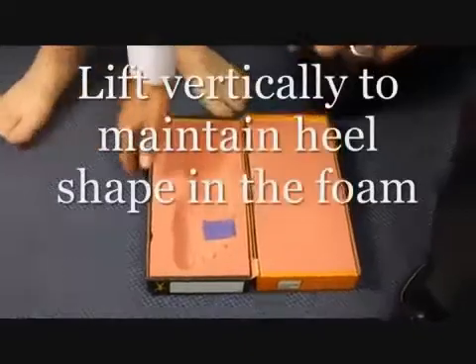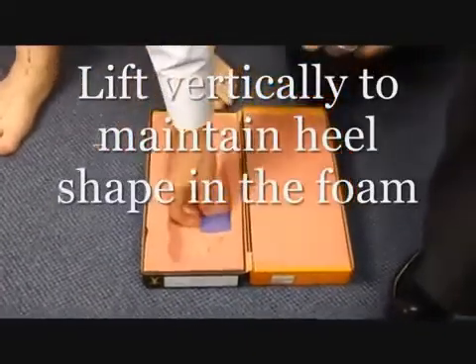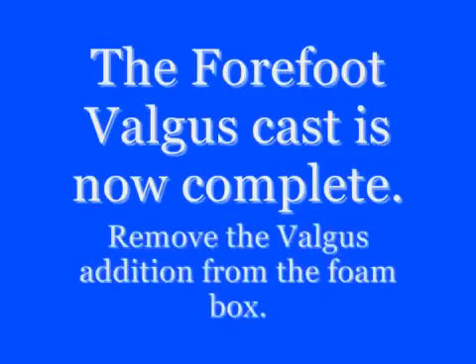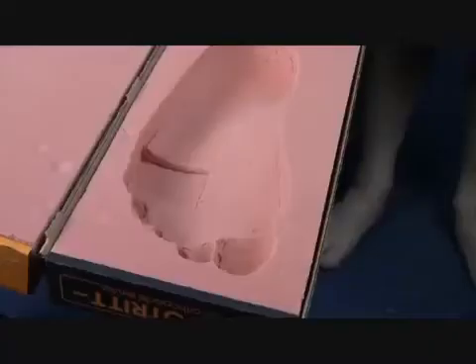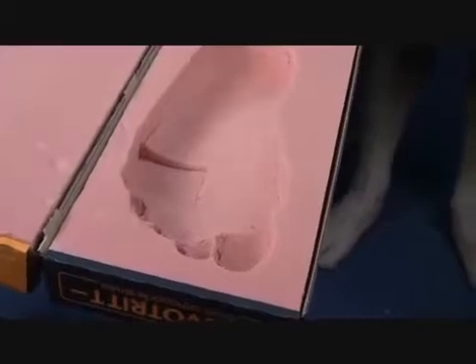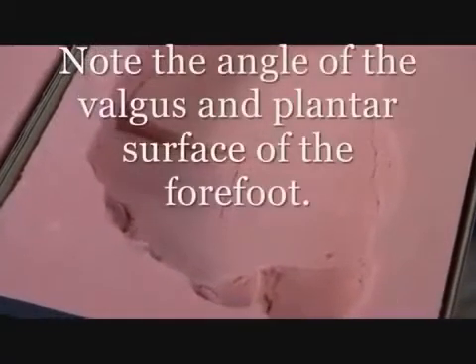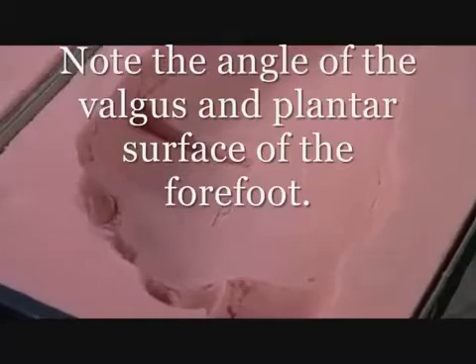Removing the foot from the foam box cast is very important. Make sure that you lift the foot vertically to maintain the heel shape in the cast. Once the EVA wedge is removed, the forefoot block will become evident in the foam box. If captured correctly, the forefoot and rear foot will sit on different planes and be clearly visible.